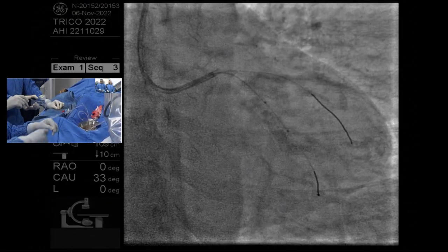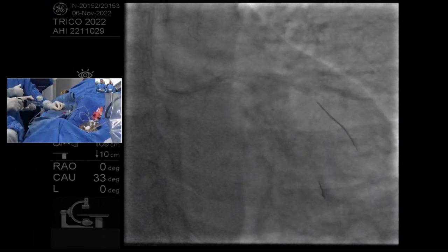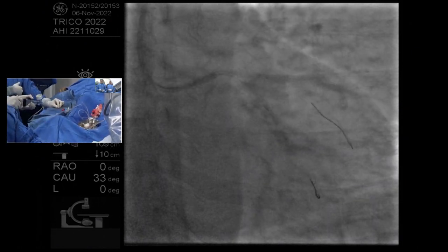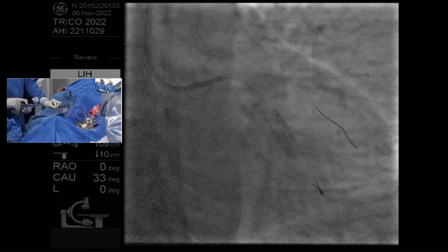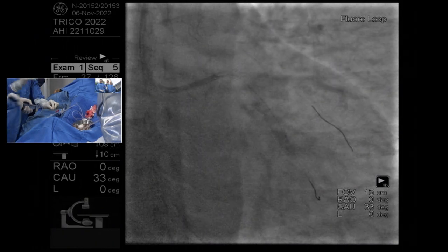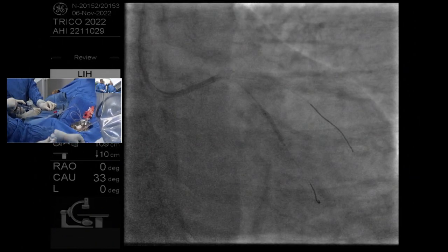Fluoro while you're doing it. We want to see the waist, yes. Fluoro while you're doing it. Now cuts start coming up. There. You see the waist? Yes. Okay, fluoro store that. Save. They will save it by default. Okay. So now you have a good handle of where the middle of the lesion was, right?